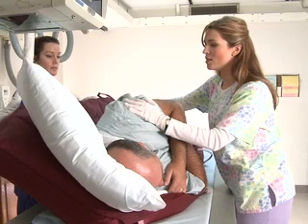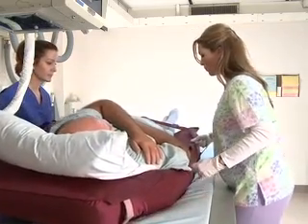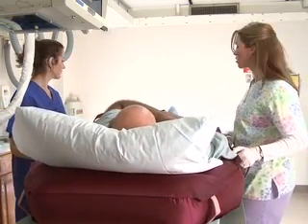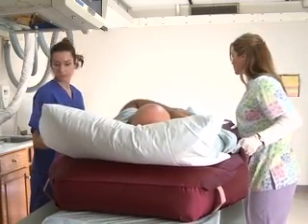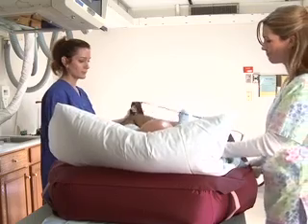As the caregiver behind the patient holds the inflated mattress handles, push the patient's body back against the inflated HoverMatt. The opposite caregiver will lower the HoverMatt until the caregiver that faces the patient can see the handles. The caregiver grabs the nearest handles and pulls the HoverMatt toward him or herself, while the other caregiver simultaneously pushes the HoverMatt until the patient is supine and centered on the imaging table. Return to the position of safety.